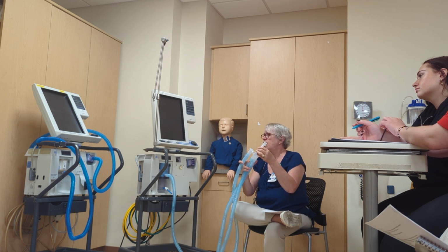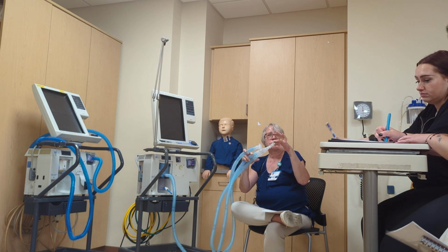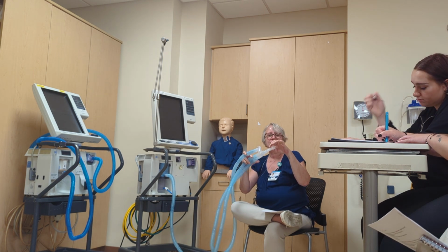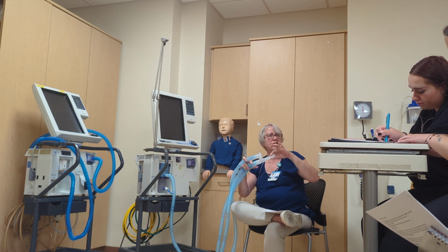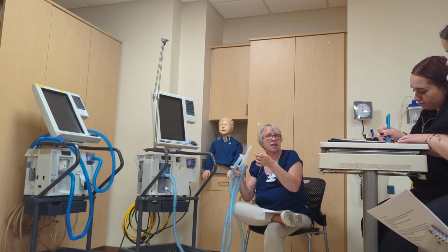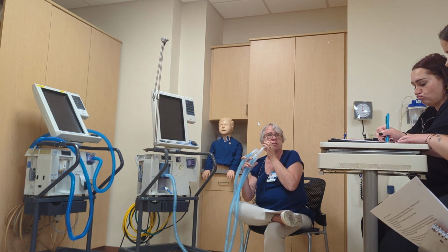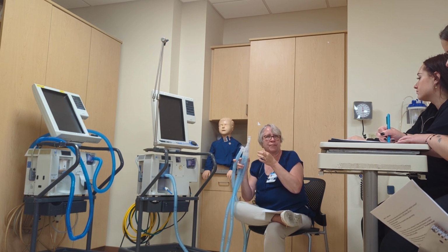I'll pull some other ones out at some point. But you don't forget your patient adapter. This adds the ability for the patient to move a little bit, so you're not gonna accidentally extubate yourself, or it's a little bit more comfortable if you have a little patient adapter on it for the patient, okay?